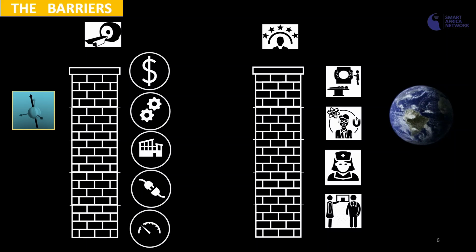The siting can get expensive too, requires a lot of power, and compared to other whole body imaging modalities is quite slow. An often less discussed topic is the lack of local resources to run and sustain these systems, such as an MR technician, a physicist, a radiologic nurse, and the radiologists themselves.